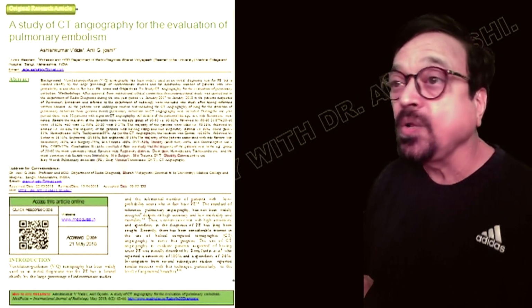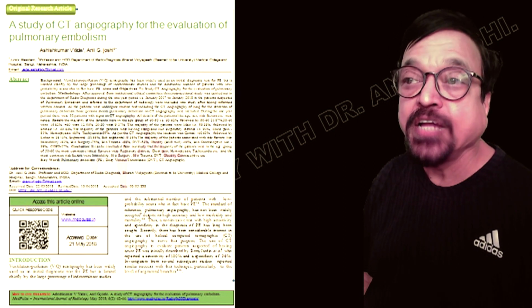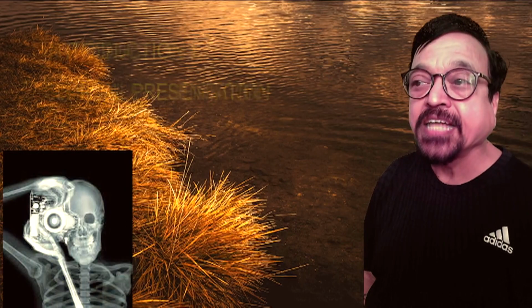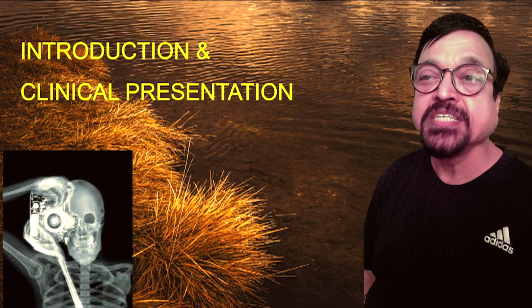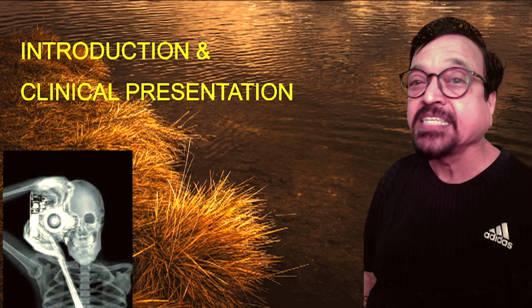This is our own publication on CT Pulmonary Angiography. It was published in an international journal by our department. Today's lecture is based on that, with some additional cases other than what we have published in a journal. So the cases in this are fresh.